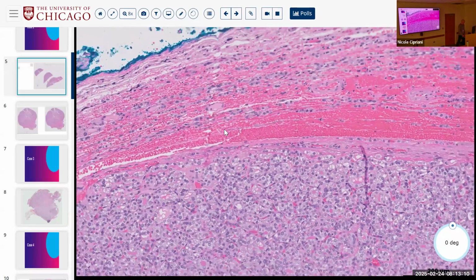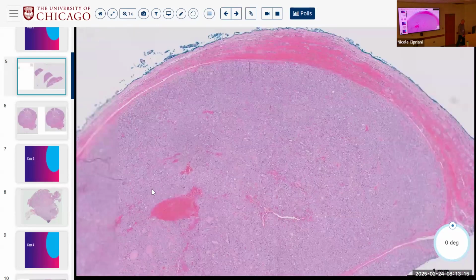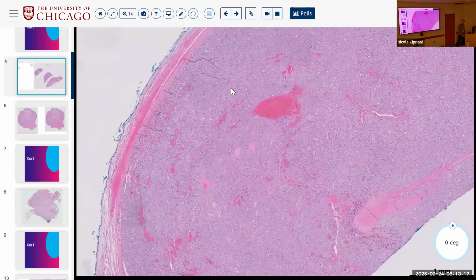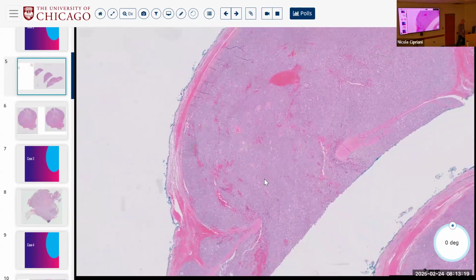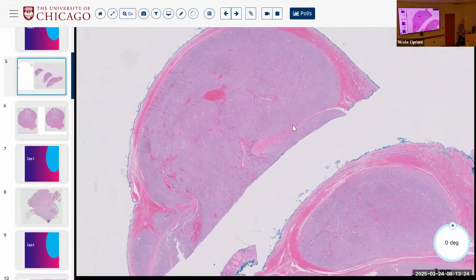Maybe go on a little bit lower power. So I think best thyroid is best really started on low power. So even here, go one lower. Do you see this shape that this thing is taking? Right here. So this would probably be broken through.